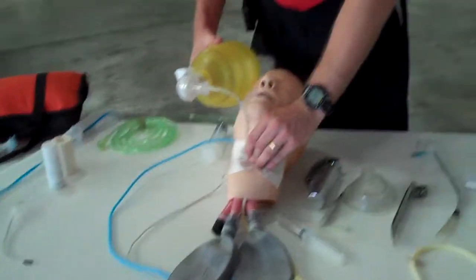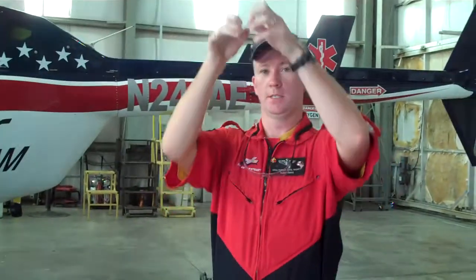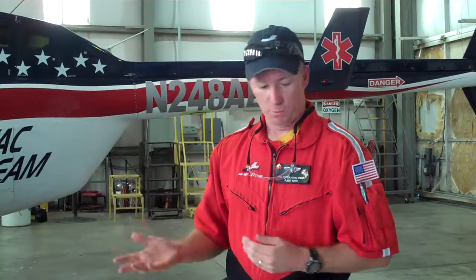If you right main, if you push the tube in too far, whether you're intubating somebody or doing a cric, the way that the morphology is on a patient's bronchus and bronchioles, the right main is up higher and more easily tubed. So if we place a tube and I only have breath sounds on the right side, I typically pull the tube back a centimeter at a time until I have left side lung expansion. One thing we look for in the field is that we keep pulling the tube back and we still don't have lung sounds. Hopefully you caught that before you were intubating, that they could have a pneumothorax, but we've assessed that prior.